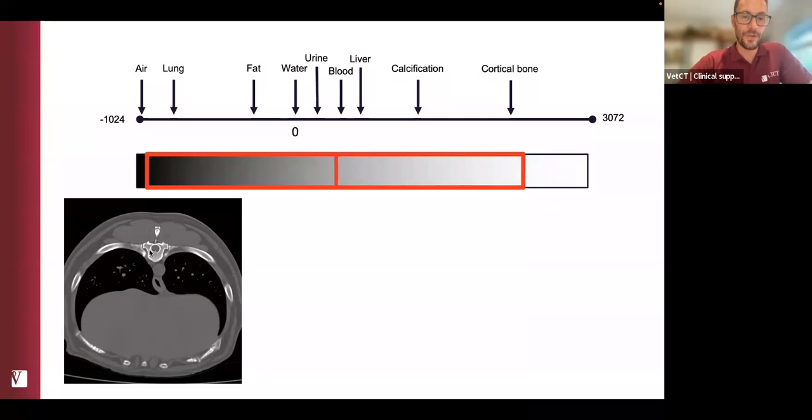We see the bone beautifully, but look at the lung. You cannot see it at the same time as the bones in detail. And if you look, for example, at the liver, we know there are blood vessels there. We cannot differentiate them. We know the liver has a different density, for example, than this muscle or than the aortic blood there. And everything looks the same because basically from water to whatever it is here, they are too close in that scale of grays.